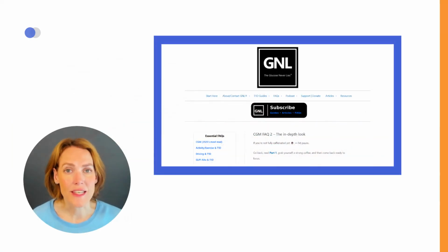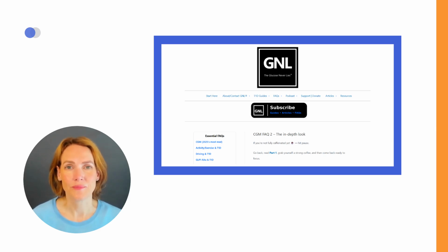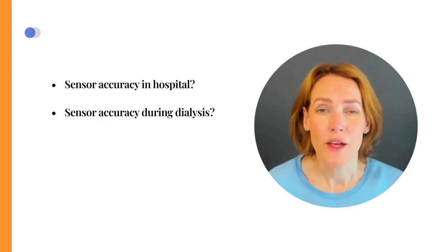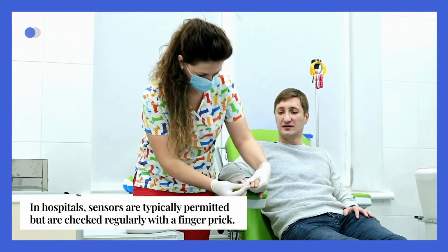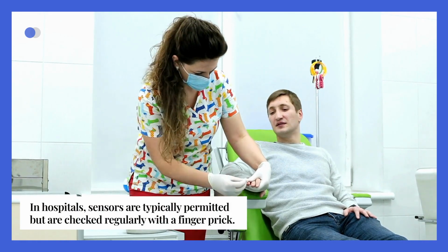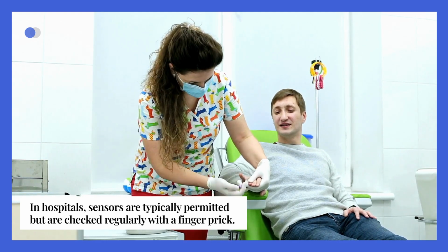For a deeper look into the accuracy of newer sensors and why MARD alone is insufficient, see John Pemberton's Glucose Never Lies blog. Hospital use and the accuracy of these sensors during specific situations such as dialysis remain topics of ongoing discussion. In hospitals, sensors are typically permitted but are checked regularly with a finger prick. Finger pricks are also advised in case of in-hospital hypoglycemia and after treating a hypoglycemia with glucose.